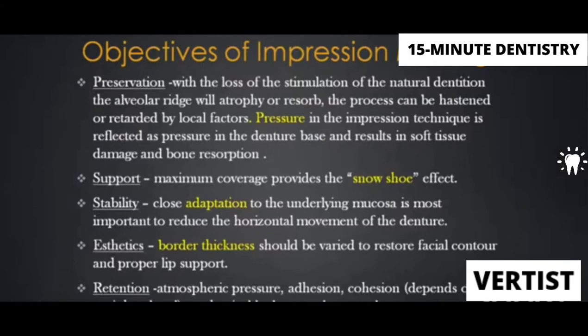Aesthetics, the border thickness will determine the aesthetics of the patient, how full the lips are or how full the cheeks are. Therefore, when you are doing your border molding and final impression, the thickness of the border is quite important. Ensure that you are checking the thickness of the border in terms of aesthetics also. And of course, there are a lot of factors in retention, out of which atmospheric pressure, adhesion, and cohesion are most important.